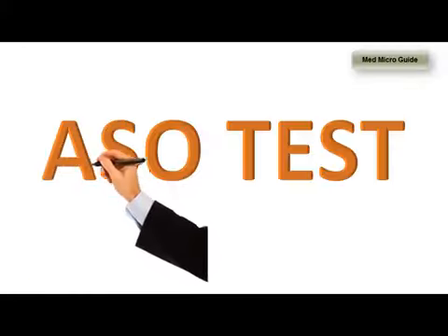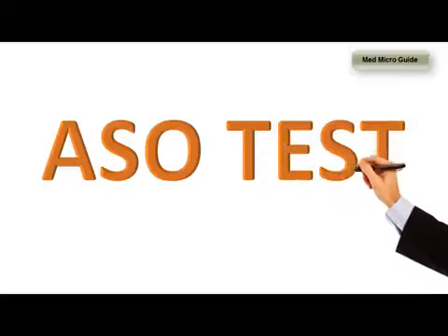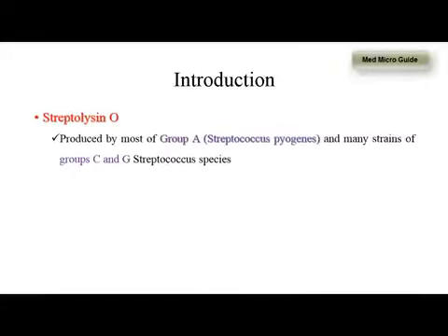In this session, we will study the anti-streptolysin O test. Streptolysin O is an oxygen-labile hemolytic exotoxin. This is produced by group A streptococci, that is Streptococcus pyogenes, and also by some of the strains of group C and group G streptococci.